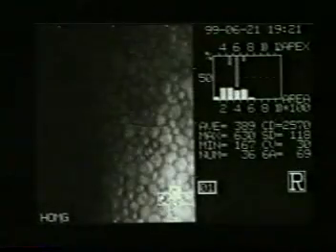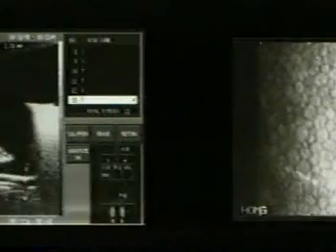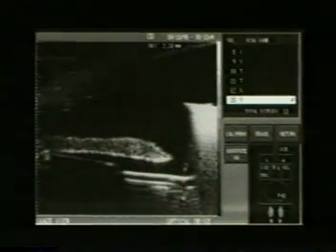Thus, the endothelial cell counts are important both in the preoperative and postoperative period. We expect a maximum endothelial cell loss of approximately 20% at 6 months postoperatively. The UBM images are used to study the perfect fixation of the telescope in the bag.